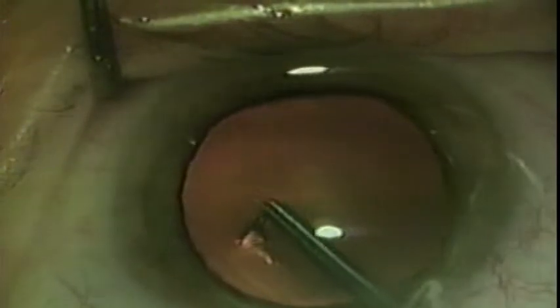In addition, the instrument is modified, allowing it to be attached to a viscoelastic syringe or an irrigating handpiece to allow for administration of fluid or viscoelastic while creating the capsular rexis.